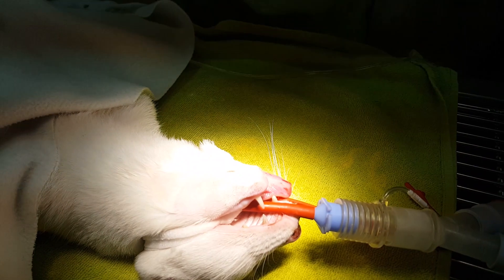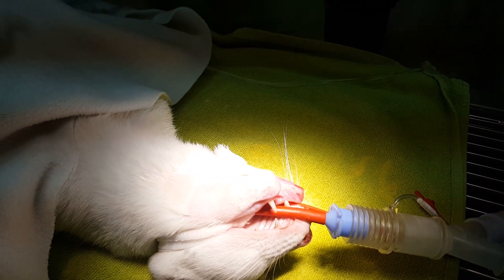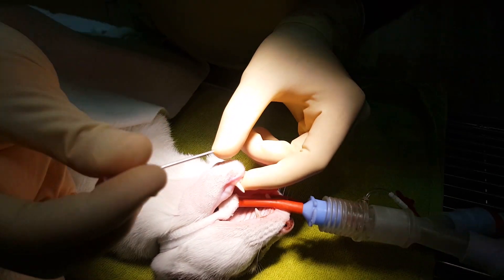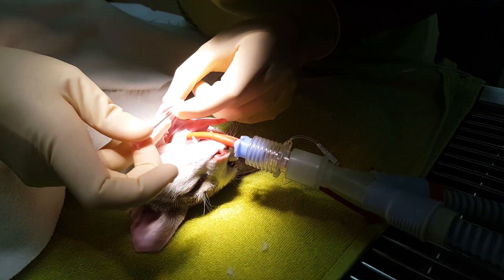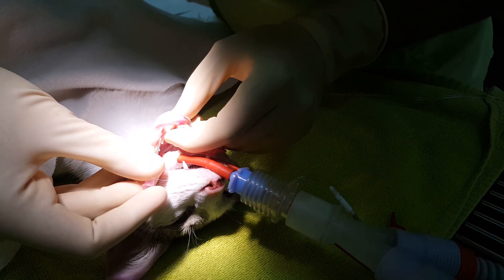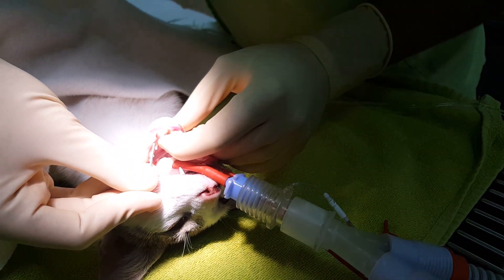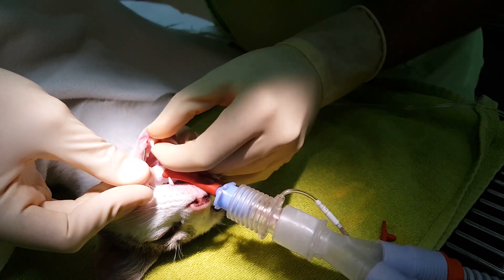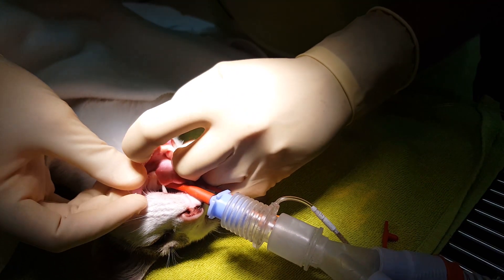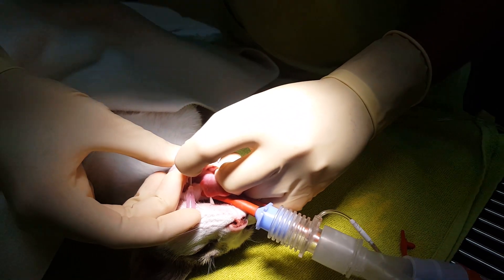The incision is just superficial — we are just making an incision on the skin. Then we're using a quite big needle to let the wire in from immediately behind the left canine to the side of the jaw, and we let the needle come out gently through the hole we made.